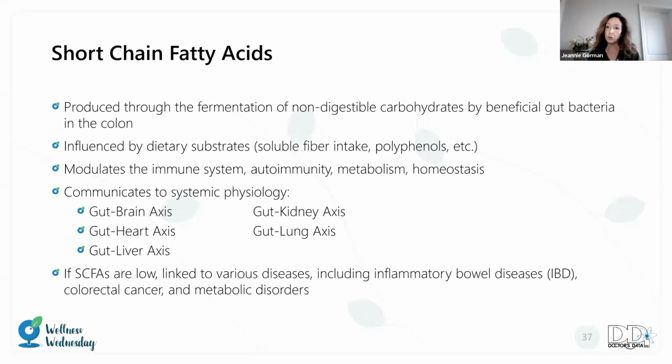They are made by the beneficial microbiome. So this panel ties into how well the microbiome is doing. And when you're investing in the microbiome with the probiotic and the soluble fiber and trying to maintain growth there, these short-chain fatty acids will, of course, benefit from that. But I will always look to see what the bottom line is with butyrate and total short chains to determine how well these substrates are being made. The short-chain fatty acids also communicate to other systemic physiology, as listed here. And if they're low, can be linked to various diseases, including the IBD patient and other disorders.